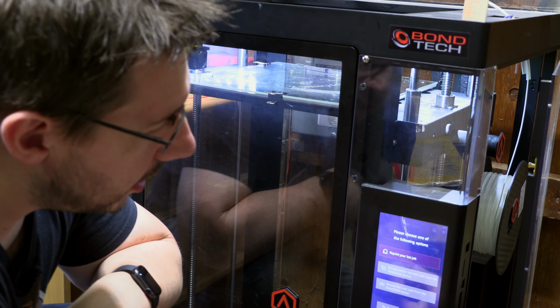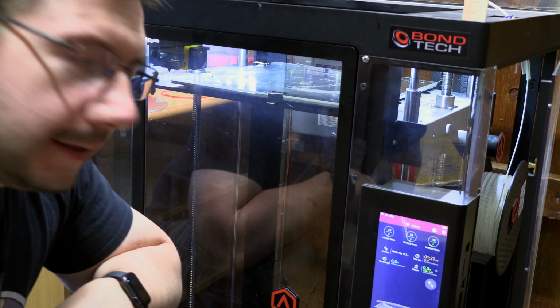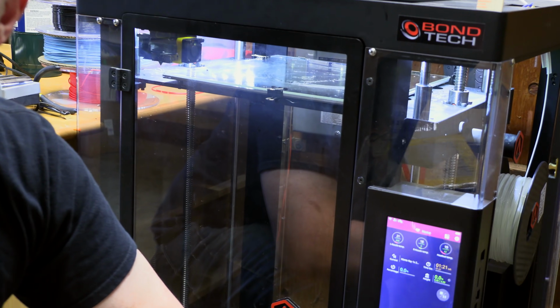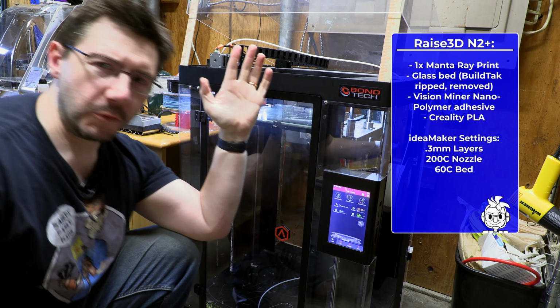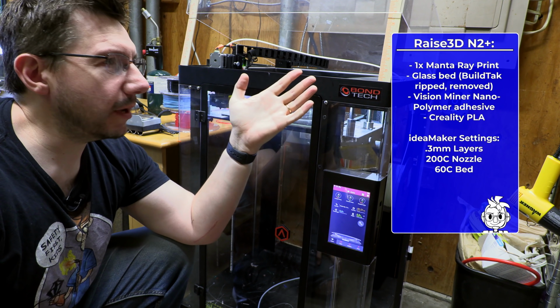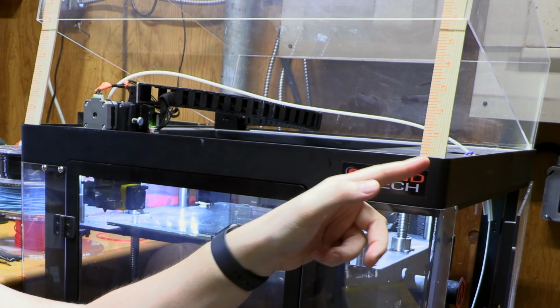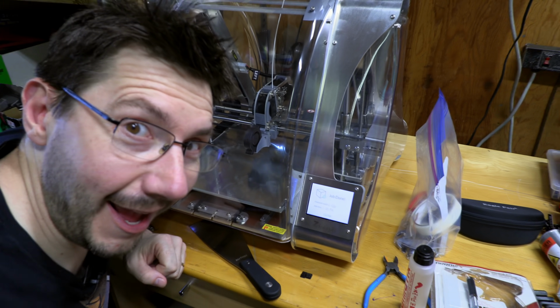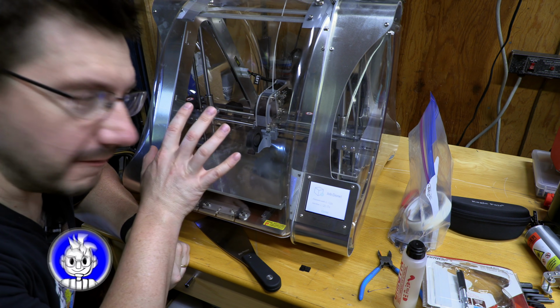Reprint your last job, and okay. And the machine kicks it off. Oh, these? Let me zoom out a bit. There's a lid on this. From the review, you remember that lid, and it's not required for PLA printing, but I don't have any place to put it. So I use these paint sticks from Home Depot, and I hold it up. Genius, right? Next machine.